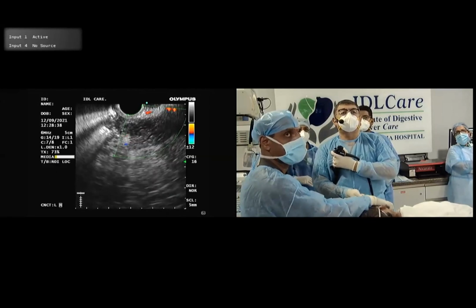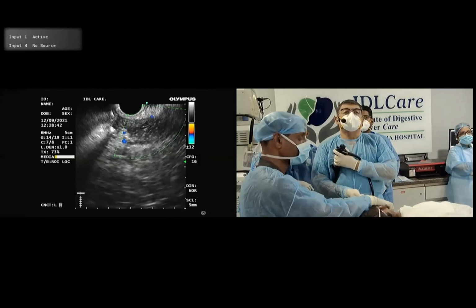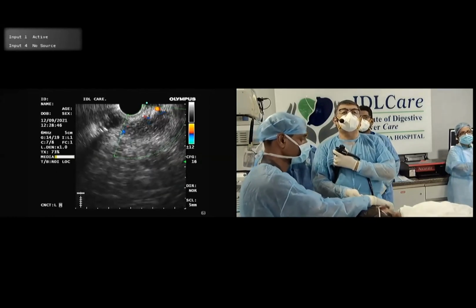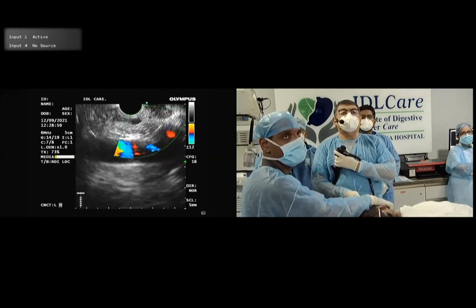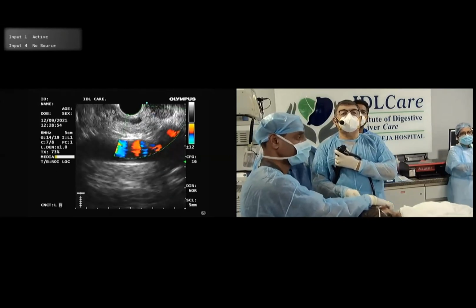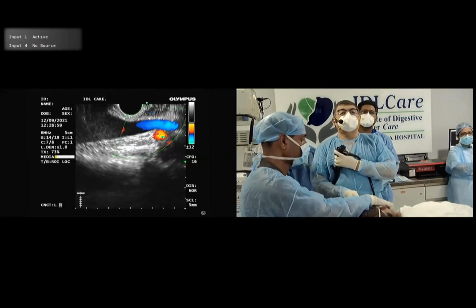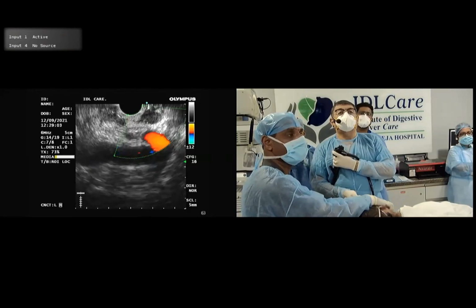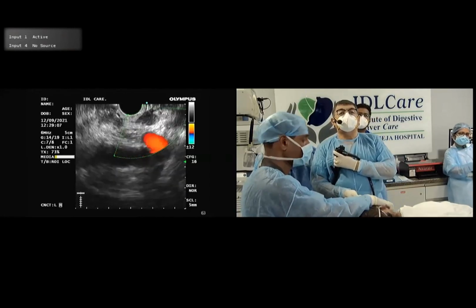Pancreatic duct. If you look a little above that, you see the bile duct, which also appears normal. It doesn't look abnormal. If you want to see the bile duct, you have to turn anti-clockwise. You see the aorta underneath. Aorta underneath means uncinate process. IVC, keep withdrawing. There is a lymph node here, as I showed you before. Looks reactive to me.